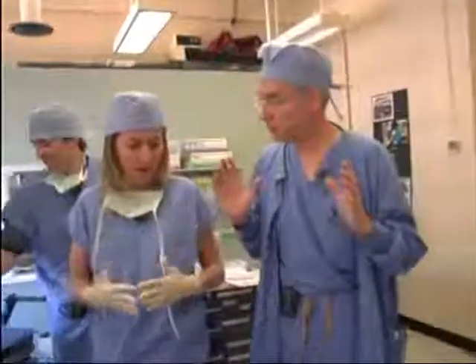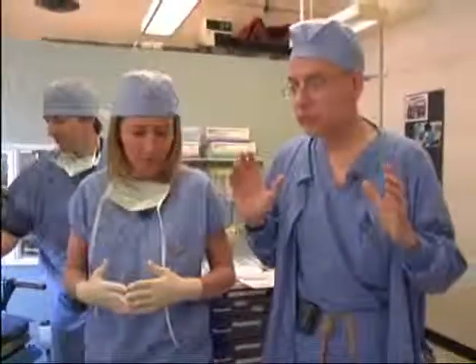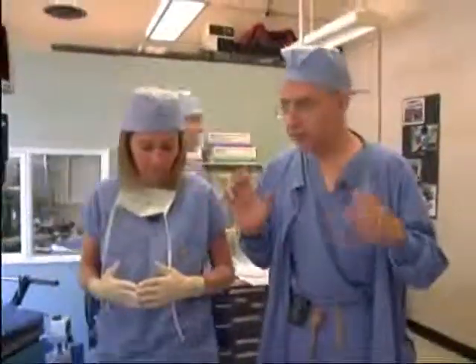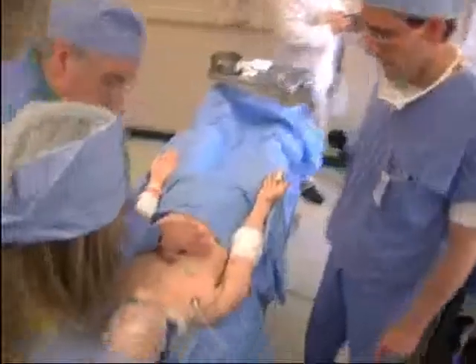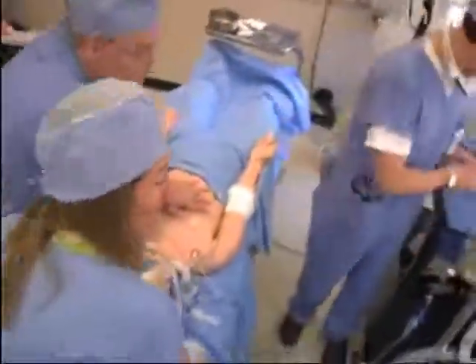I am sweating. Now, have you noticed anything funny? Were you hearing some kind of rhythmic thing that you're not hearing now? That beep, beep, beep of his heart. Oh, yeah. What happened to his heart? Oh, no, wait. Oh, my God, it stopped. Oh, my God. So reach down here and see if he's got a pulse. Okay. I've got to start CPR. Okay. And then, Dr. Kryman, can you get some epinephrine ready? We still don't have a heart rate.